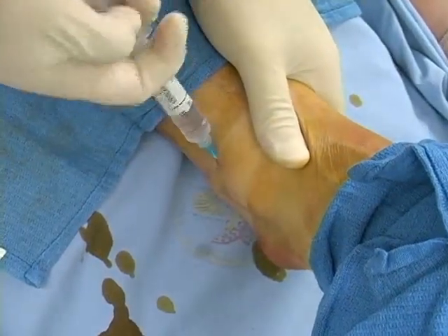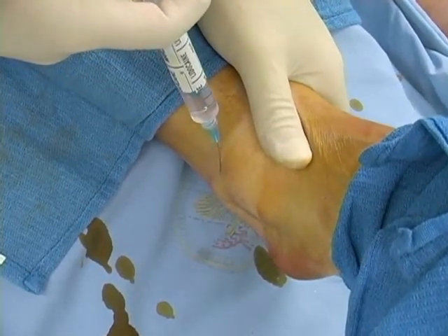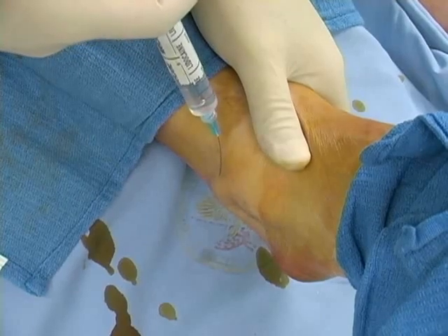Direct the tip of the needle toward the fibula and inject anesthetic as the needle is withdrawn. Again, raise a cutaneous wheal as the anesthetic infiltrates the tissue.